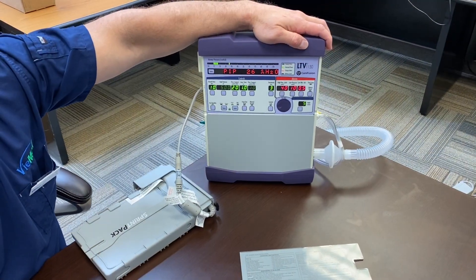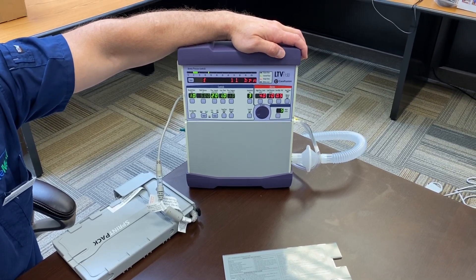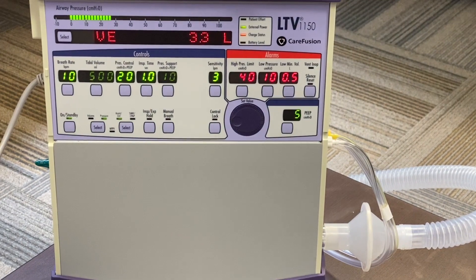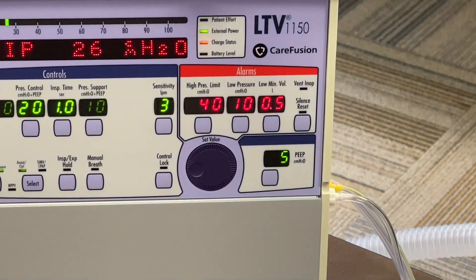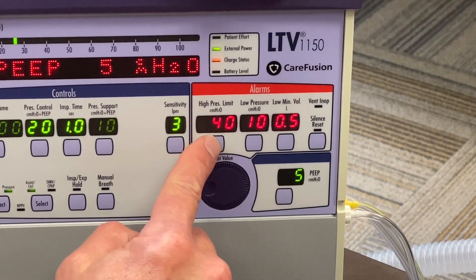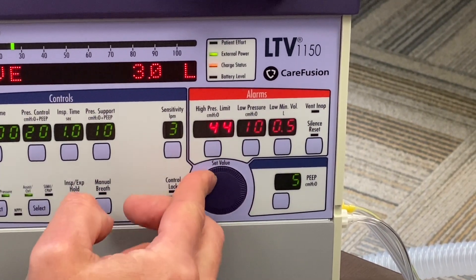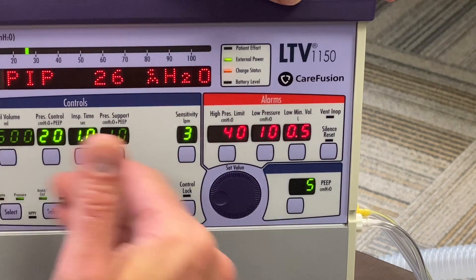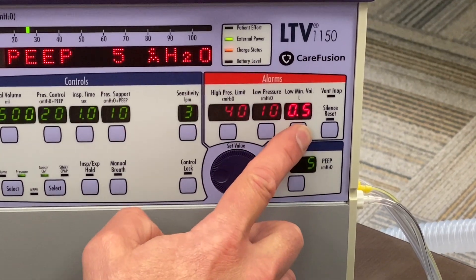Back to the LTV 1150. We had an earlier video covering basic setup and how to navigate controls and settings. Now we're going to talk briefly about the alarm package and the shutdown procedure. The alarm package is displayed in this window and is operated exactly like every other setting on the machine. If you want to set or change a limit — for example we're running about 28, so if we wanted to reduce or raise it — use your toggle. When you reach the value you want, select again: it's accepted and everything returns. The same applies for low pressure and low minute volume.